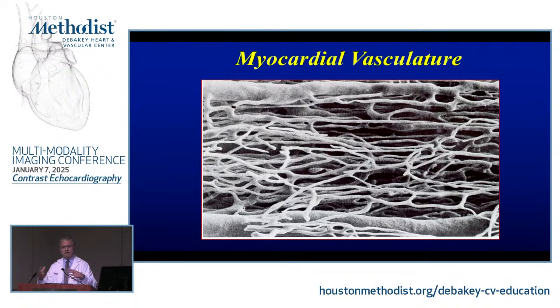You see contrast in the ventricle and the atrium, right? And remember, ultimately, they're going to go through the arterioles and the capillaries. Interestingly enough, the velocity of the blood in the cavity and in the aorta, you see that usually in centimeters per second. But you need to know that at the capillary level, the velocity is very low.